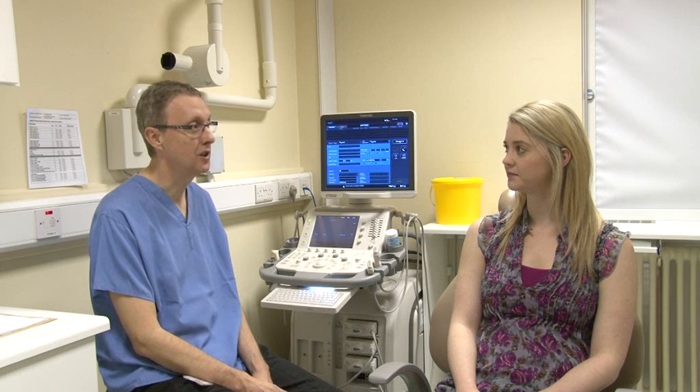Hello there, my name is Nick Drage. You've been referred by your consultant regarding a swelling in your neck. Once seated, the radiologist will explain the procedure to you.